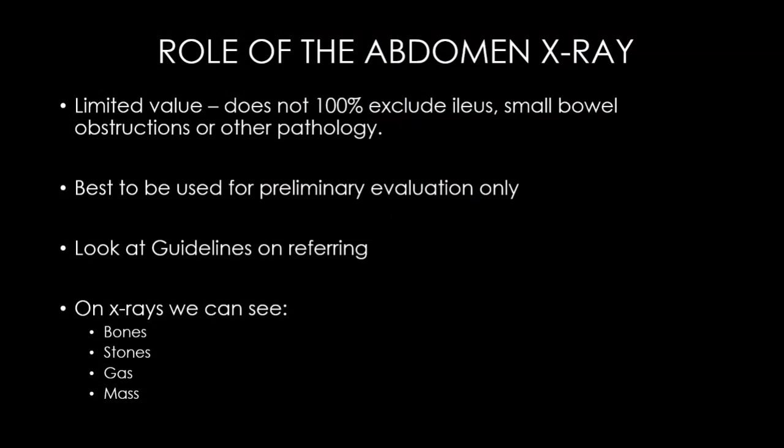Right then, so the role of abdomen x-ray, it has limited value these days compared to what it used to. CT is the gold standard to look for things like bowel obstruction, but patients presenting with acute abdominal pain warranting hospital admission for consideration of surgery, it does play a role.